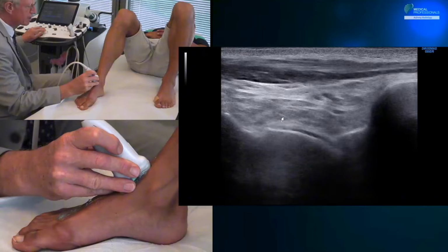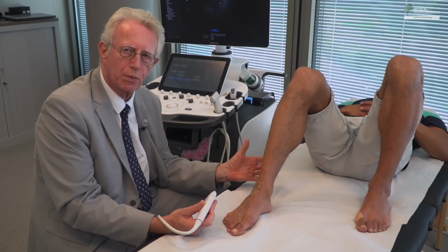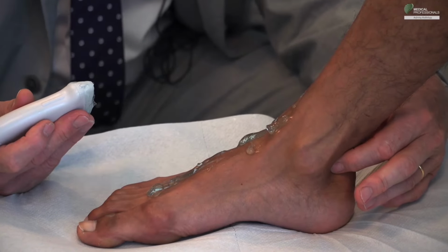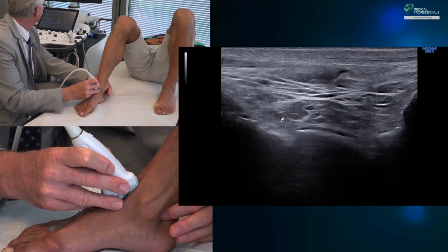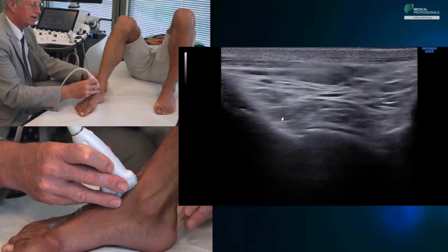We look for fluid in this area, but when the foot is in this position, the fluid is sometimes expelled posteriorly. To see it, Dr. Bourdet taught us a very practical trick, which is to press the pre-Achilles space here and find out if there is fluid distension during this maneuver.